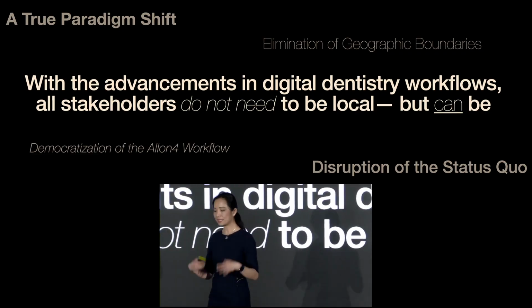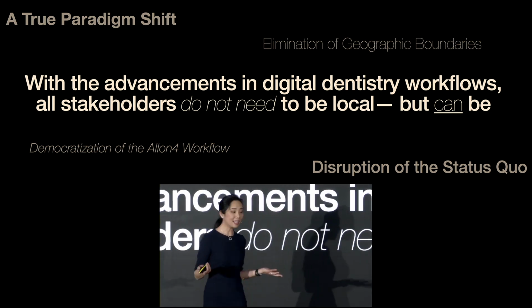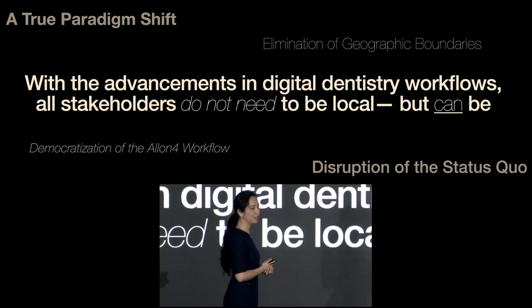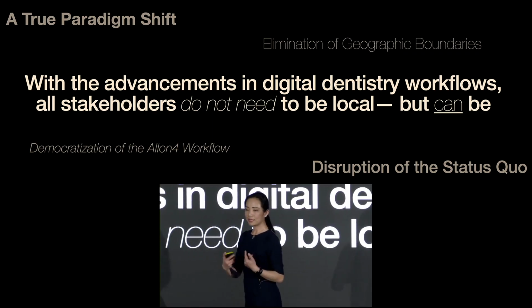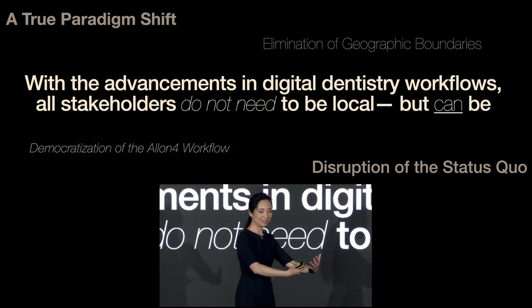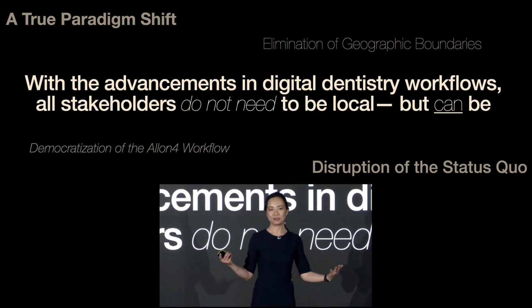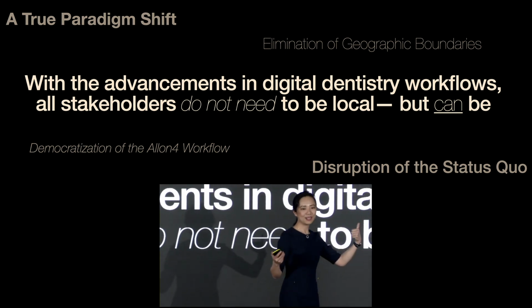So with the advancements in digital dentistry workflows, all stakeholders do not need to be local, but they can be. Because what happens is that, guess what? If, say, you have an ICam and you decide to do the full arch scan, you can send that data to just about anyone who knows how to process it. And that was one of the biggest game changers for me, because when I moved from LA to Seattle, I could continue sending data back to the lab I originally worked with and not miss a beat in terms of timeline, because I no longer have shipping fees. I just have to make sure it's in Dropbox and they got my info.